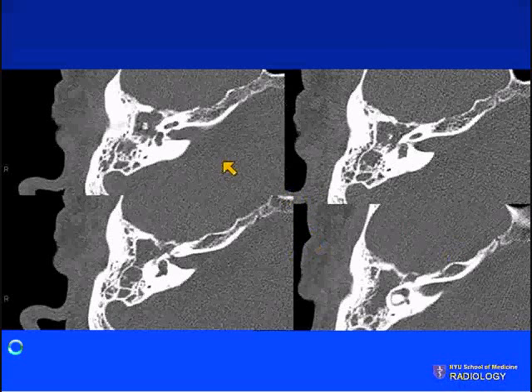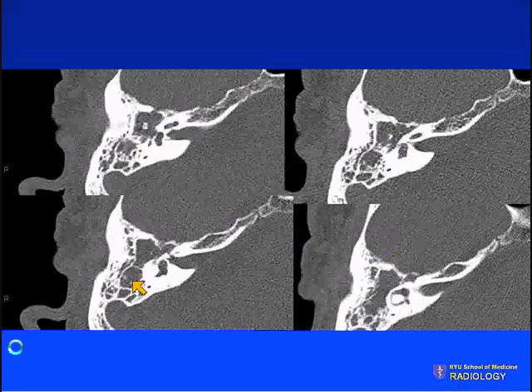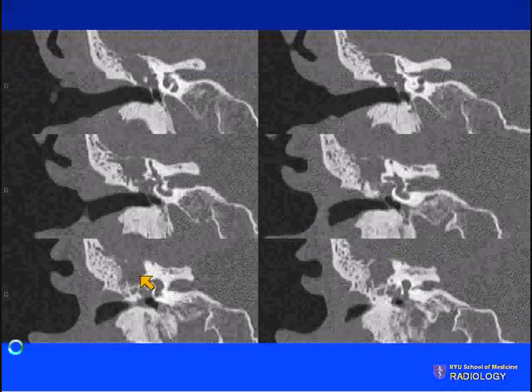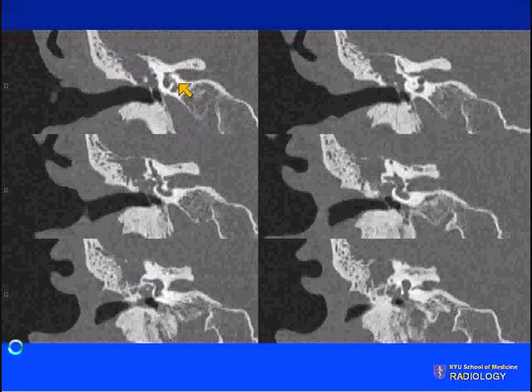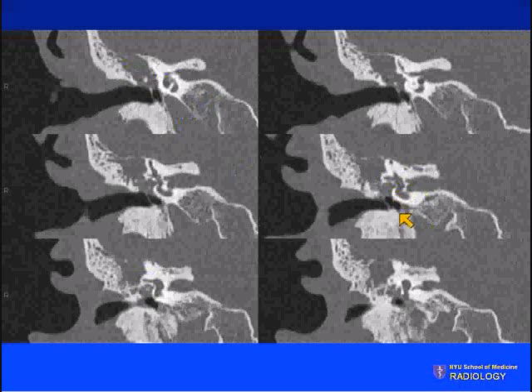In acquired cholesteatoma in an adult, we can see soft tissue filling the middle ear with expansion of the attic and antrum, and erosive changes of the head of the malleus and portions of the body. On coronal images, there is soft tissue within the mastoid air cells, with thinning and dehiscence of the tegmen. We always want to evaluate the lateral semicircular canal to ensure no fistula formation. In this case, we can see erosive changes along the horizontal segment of the facial nerve.